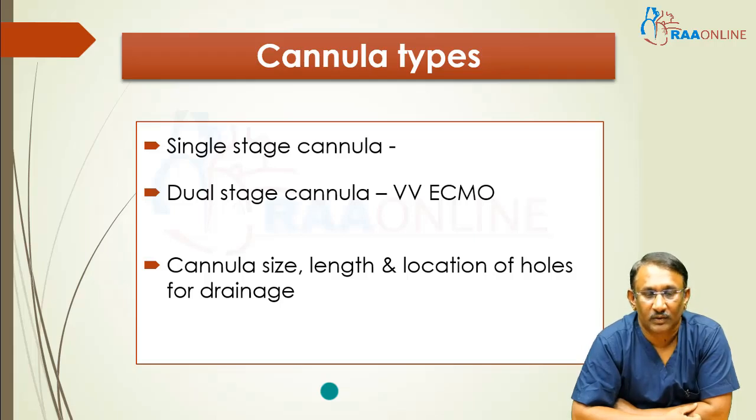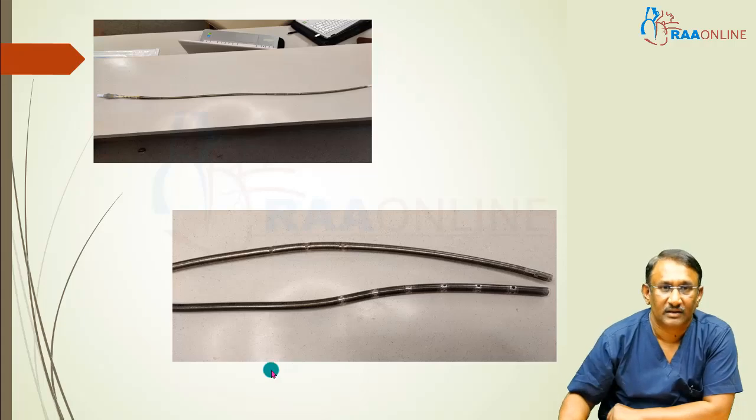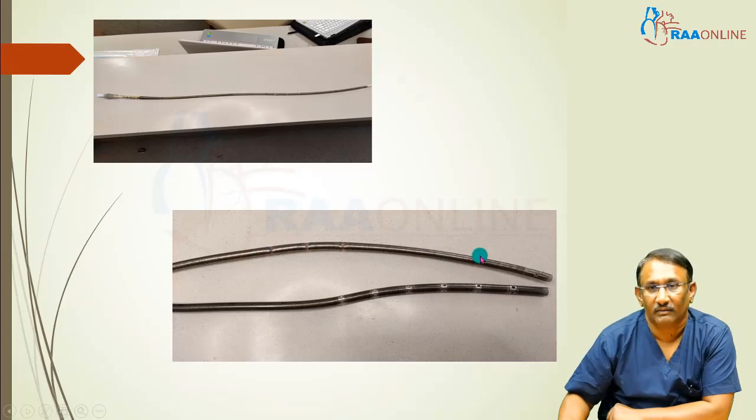Apart from this, what you need to know about cannulas is the size of the cannula, the length of this particular cannula, and the location of the holes for drainage in that particular cannula. As you see here, these are all drainage cannulas. Drainage means most commonly the venous cannulas. Both of these cannulas are of the same type, but the difference is the location of the holes. In this particular cannula, which is above, you have holes in the distal part, and in between there is an area where there are no drainage holes. Then again there are some holes here. Whereas the lower one has continuous holes from the distal end to a certain level.